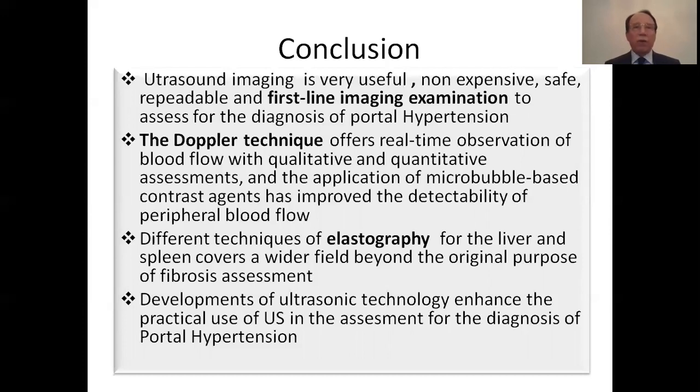Different techniques of elastography for the liver and spleen cover a wider field beyond the original purpose of fibrosis assessment. Developments of ultrasonic technology enhance the practical use of ultrasound in the assessment for the diagnosis of portal hypertension.